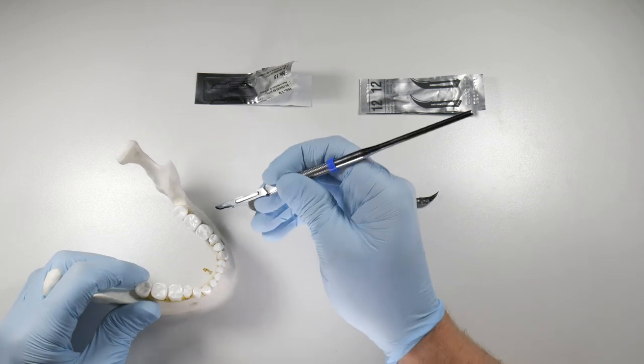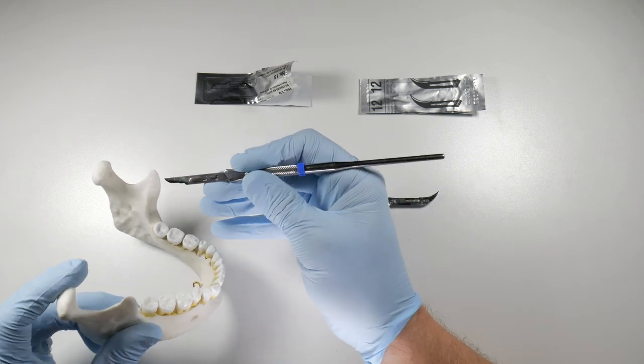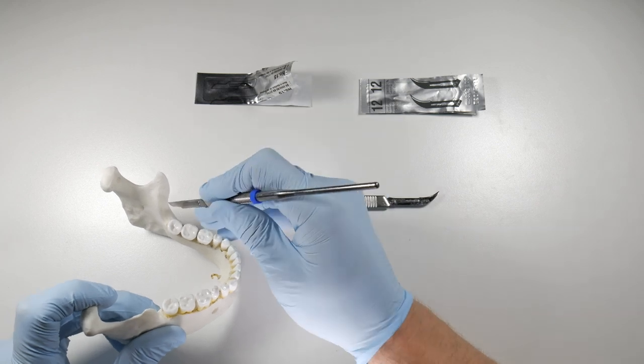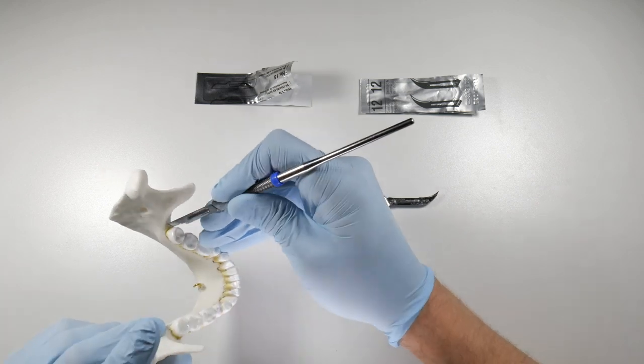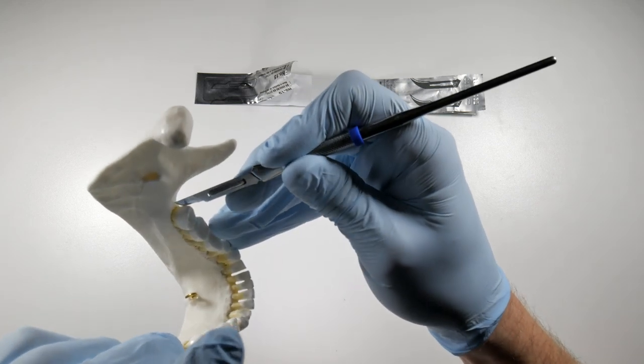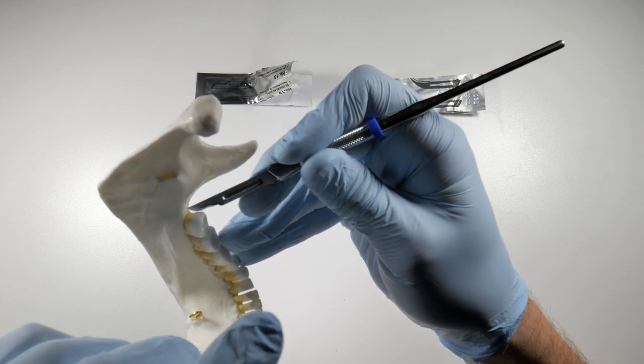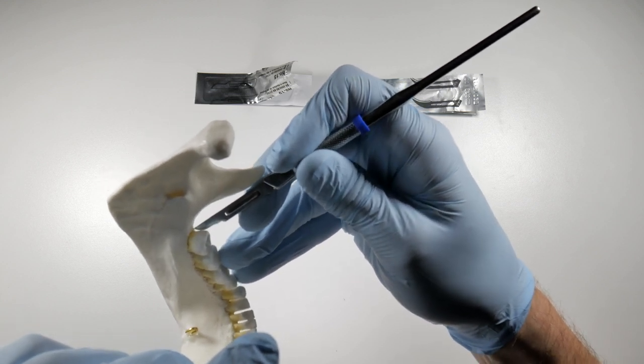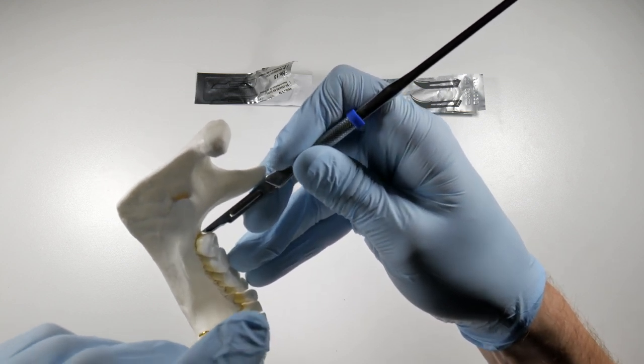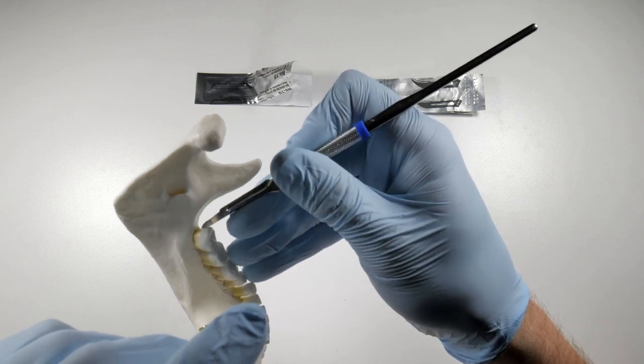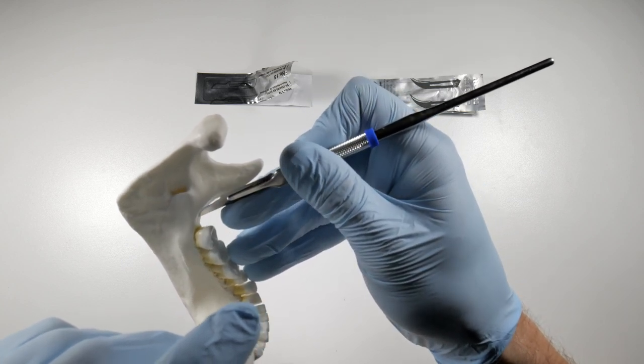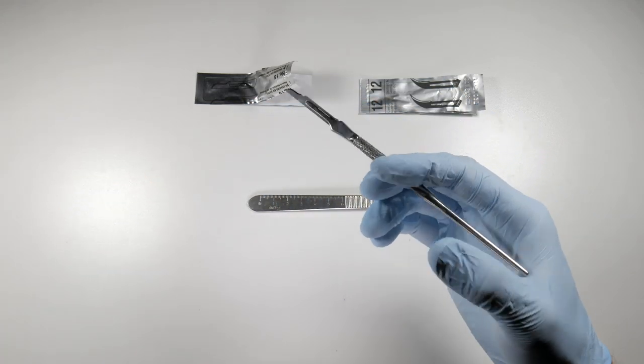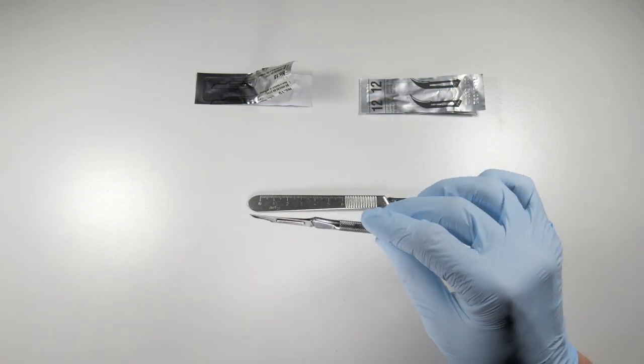When you're cutting, you can see what happens - you have this kind of contoured, rounded edge. As you get close to where you're cutting, you can see that little space there. That is an incomplete incision and it's very tough to get all the way there, so by turning this around now we can finish that off. That's a little tip about releasing your flaps, getting a complete incision.